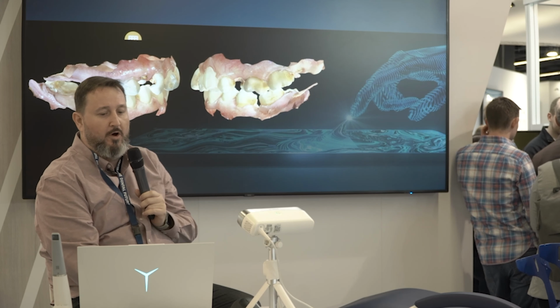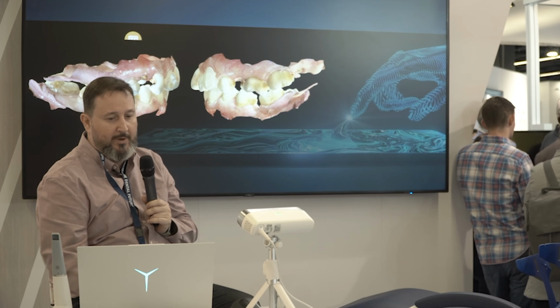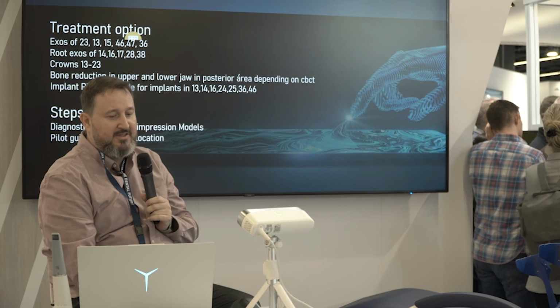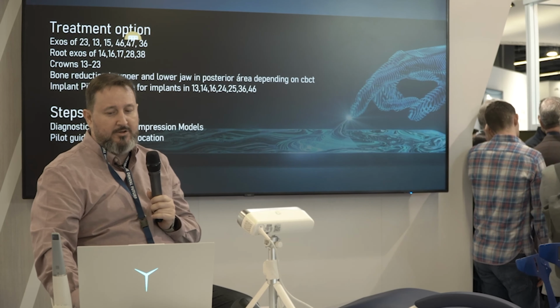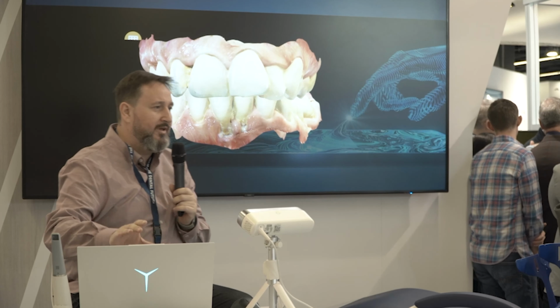It's a class 2 with overbite, vertical extrusions, no place for posterior teeth. So this is what we plan with all the team. These are treatment options, extractions, it doesn't matter. It's just a matter of bone reduction and pilot guide. Okay. This is what we usually do.